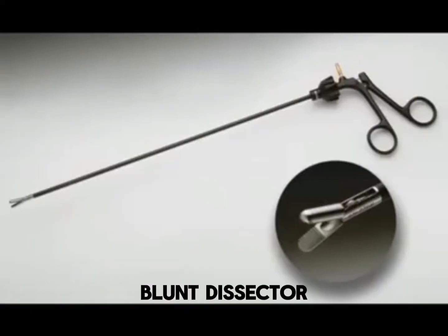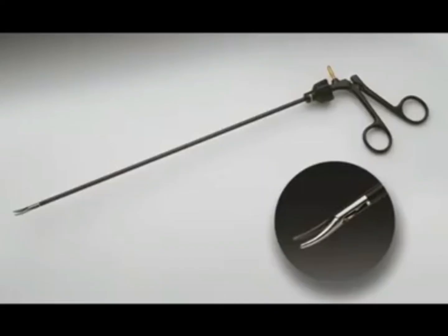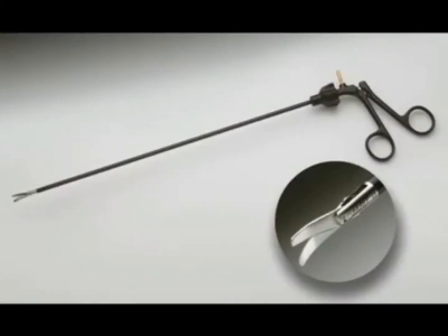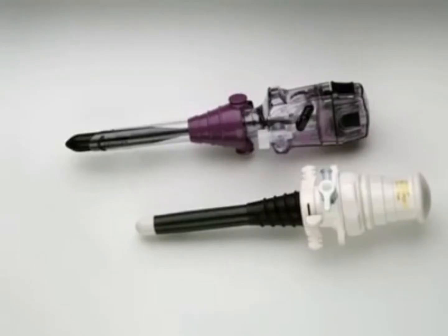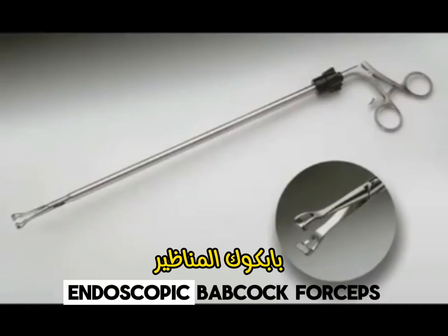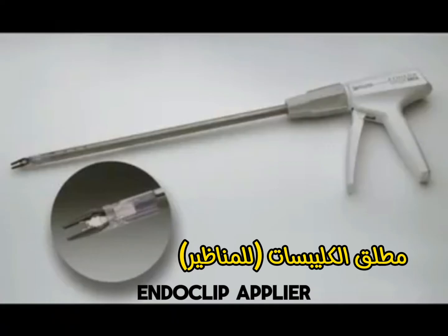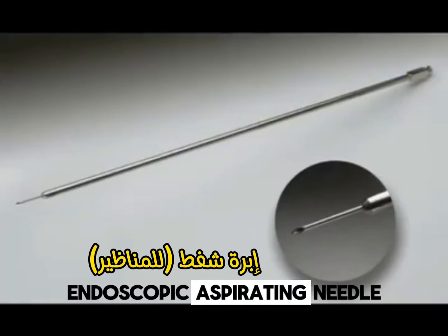Blunt Dissector. Maryland Dissector. Endoscopic Scissors. Blunt Trocars. Endoscopic Babcock Forceps. Endoclip Applier. Endoscopic Aspirating Needle.